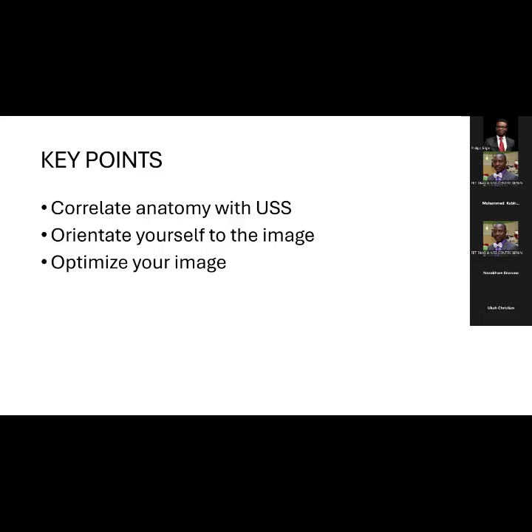Okay, so there is a question here. Where do we aim for placing the probe during transvaginal scan? Is it anterior or posterior fornix? Well, just like the anatomy we mentioned earlier on, you place the probe in the anterior fornix for the uterus that is antiverted. Whereas if the uterus is retroverted, you won't be able to place it in the anterior fornix because the cervix will be there. So you are going to end up putting it in the posterior fornix.